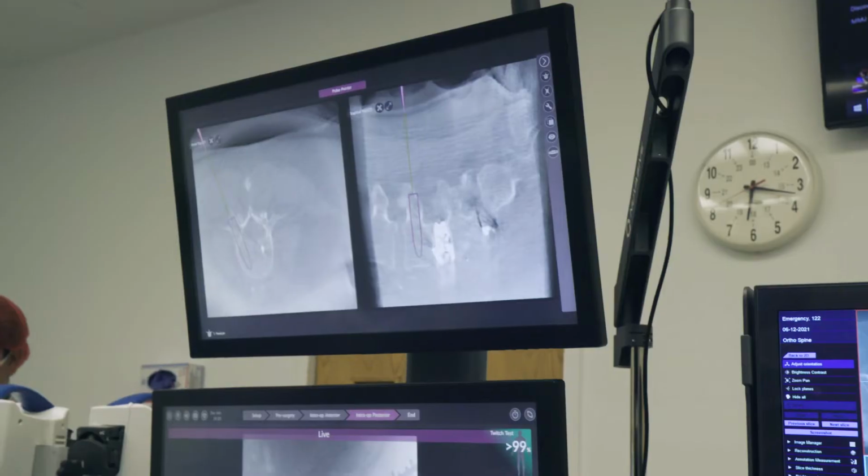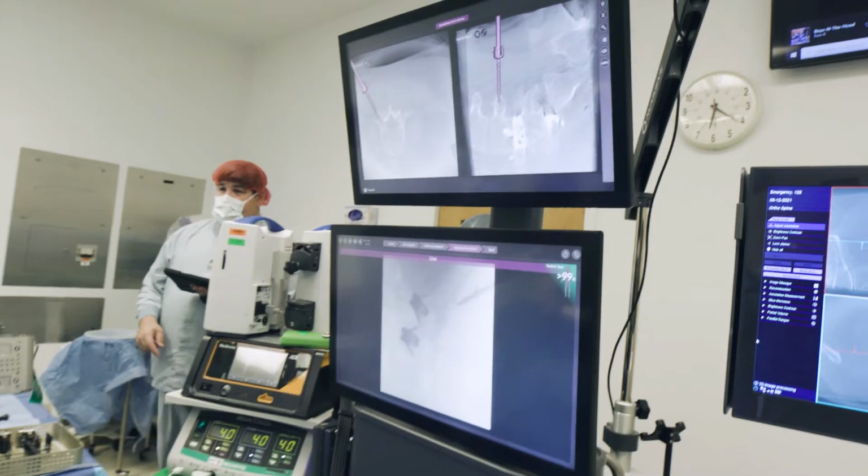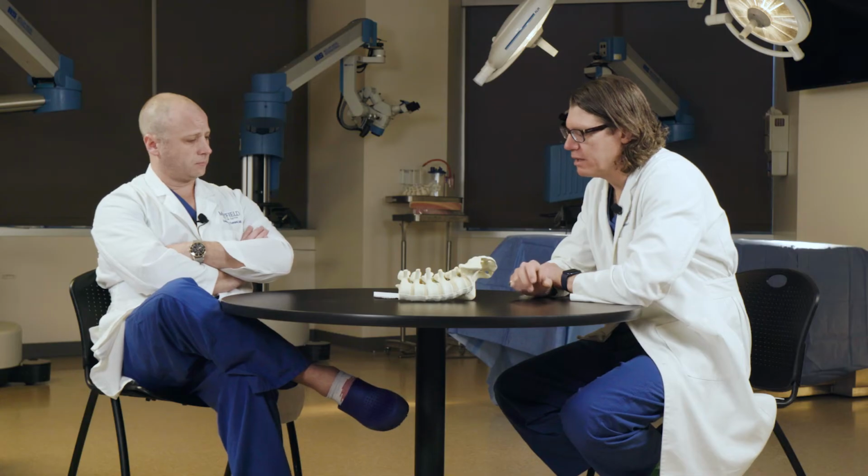Absolutely. For me, using it for that 1 and 2 level case or 3 level case and being able to look at the parameters now and measure them, I know exactly what kind of lordosis I need. I'm not guessing at what ALIF cage I want to put in, right? I'm not guessing at how much I want to dial up that TLX cage. I know what I want.